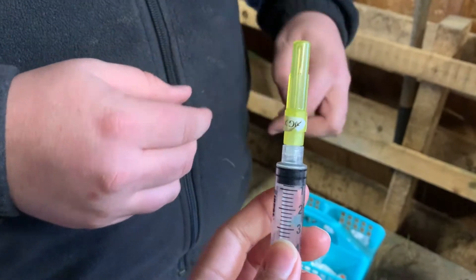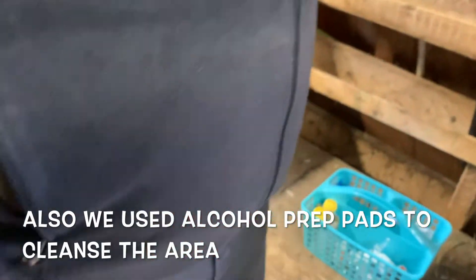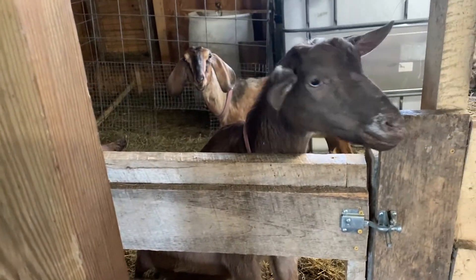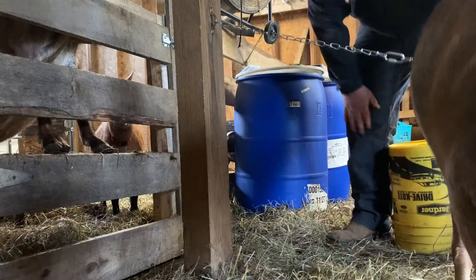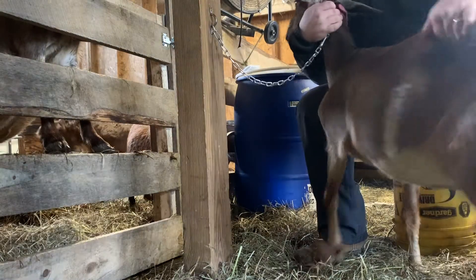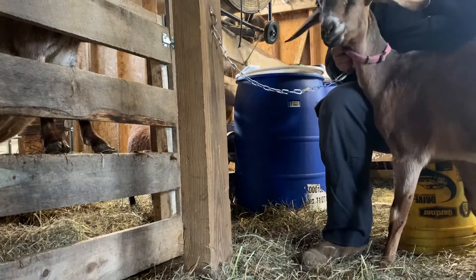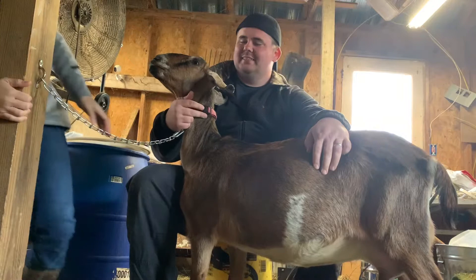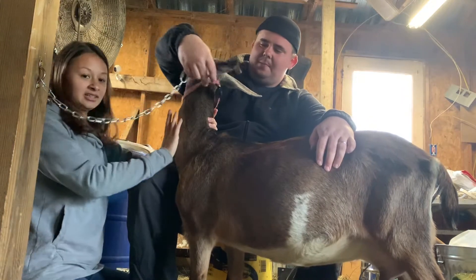We need to get two cc's for the sample. Now we're going to bring out another goat and show you how to do it. We're hooking the goat onto our feeder right here, and Fred's going to hold her.